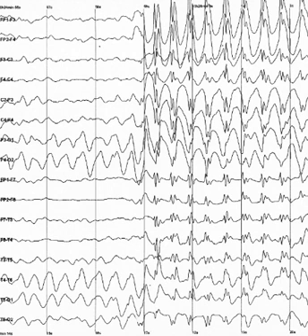EEG poorly measures neural activity that occurs below the upper layers of the brain, the cortex. Unlike PET and MRS, it cannot identify specific locations in the brain at which various neurotransmitters, drugs, etc. can be found. It often takes a long time to connect a subject to EEG, as it requires precise placement of dozens of electrodes around the head and the use of various gels, saline solutions, and/or pastes to keep them in place, although a cap can be used. While the length of time differs depending on the specific EEG device used, as a general rule it takes considerably less time to prepare a subject for MEG, fMRI, MRS, and SPECT.